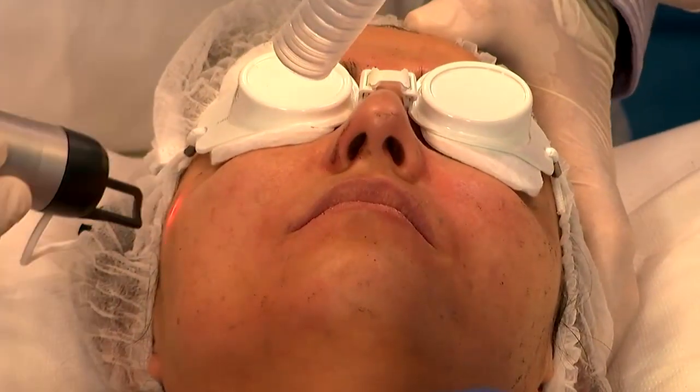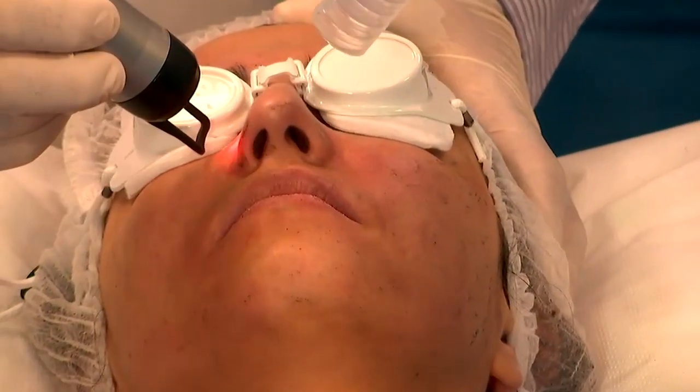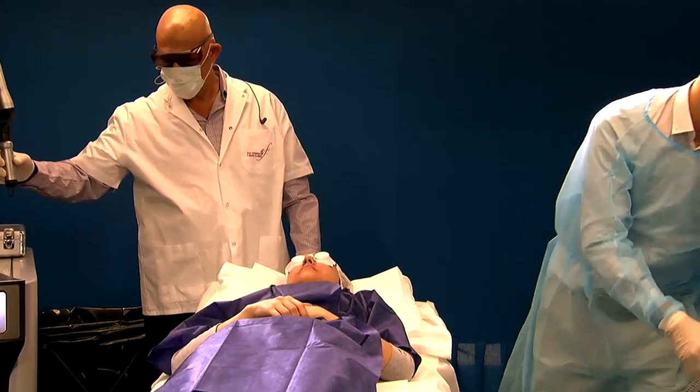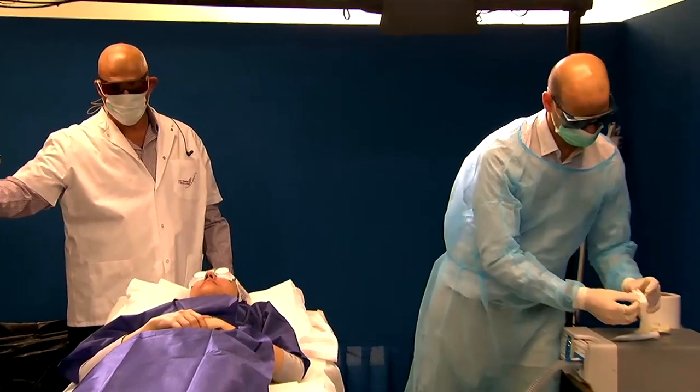And we hit every single piece of carbon that is there — none left. So that's it. Now we clean her up, we put some cream on it, and that's it.